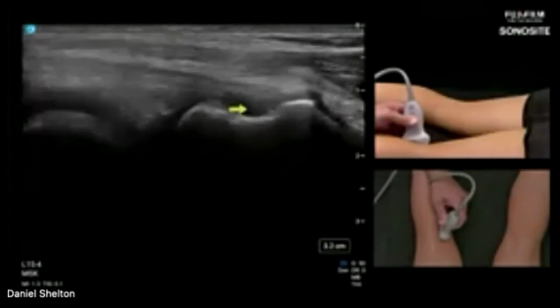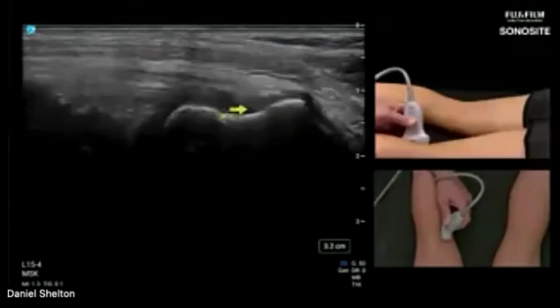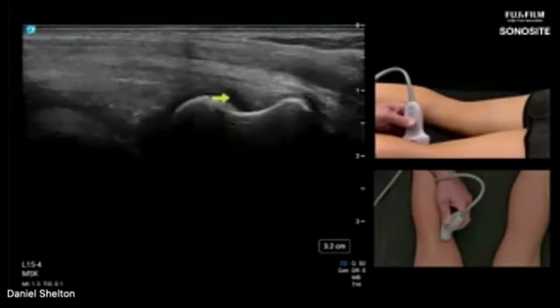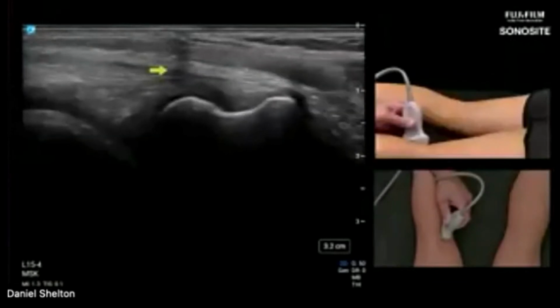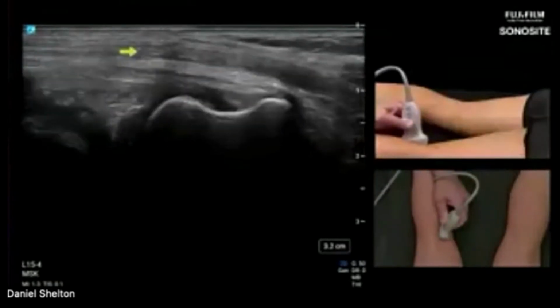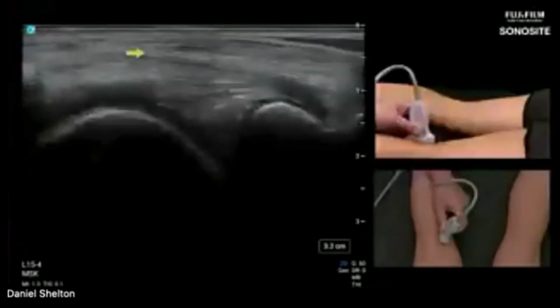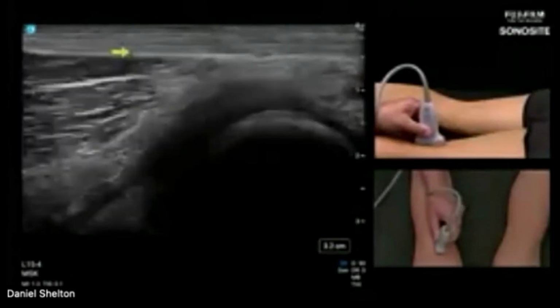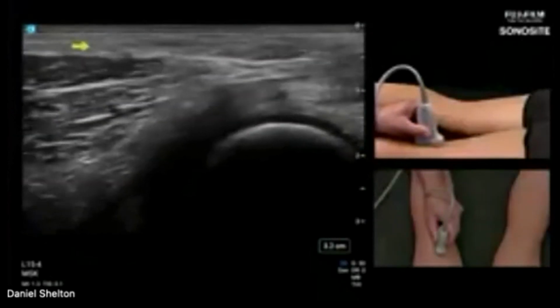Now, superficial to that, kind of like the ankle, if you've ever scanned a long axis of the peroneal tendons where the brevis and longus sit on top of each other, this looks a lot like that same view, just bigger. So here, superficial to that is our semitendinosus long axis, and I can confirm that by chasing it up proximally. It's a very thin tendon set superficially, and I can sonopalpate it with my fingers right down the side of the transducer. So just clarifying all these landmarks.